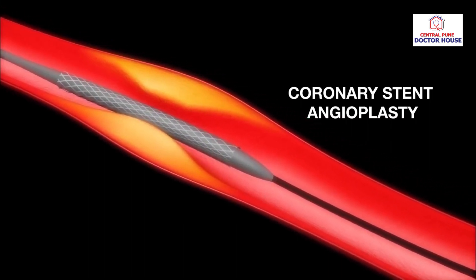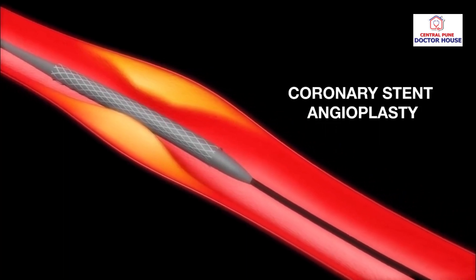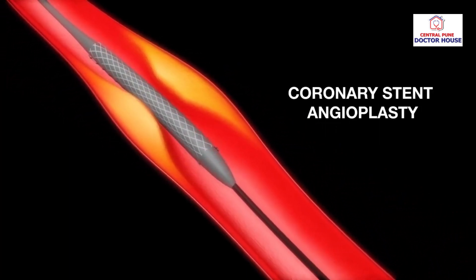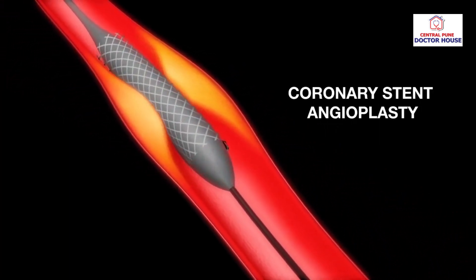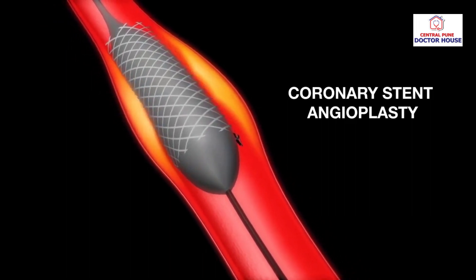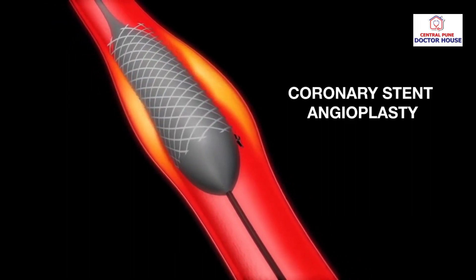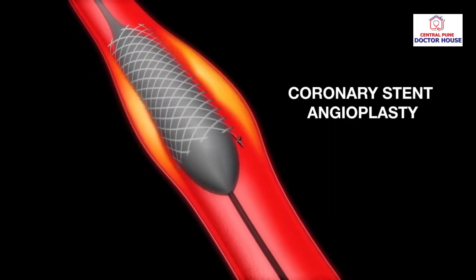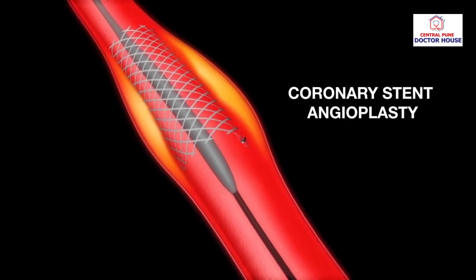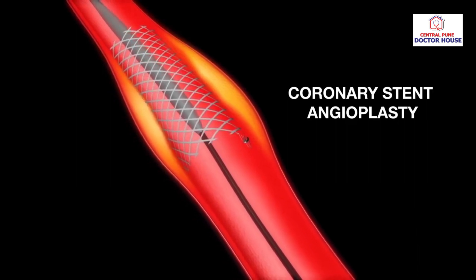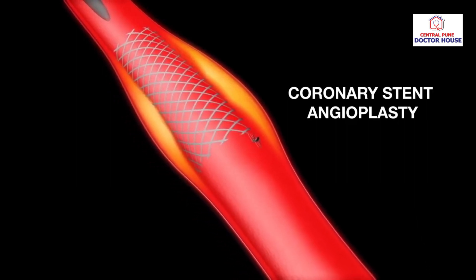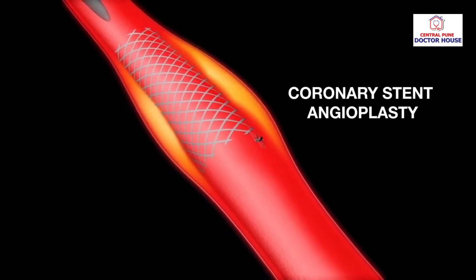When the balloon is inflated, the stent expands and locks itself into place. The deflated balloon and catheter are then withdrawn, leaving the stent behind to hold the artery open permanently.